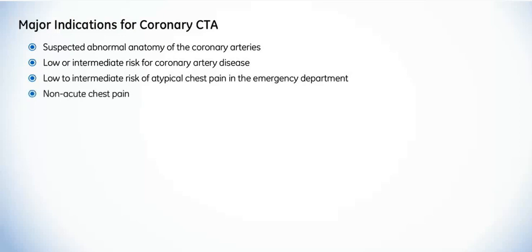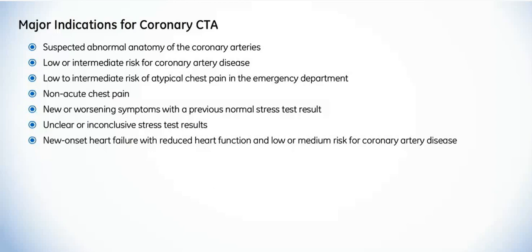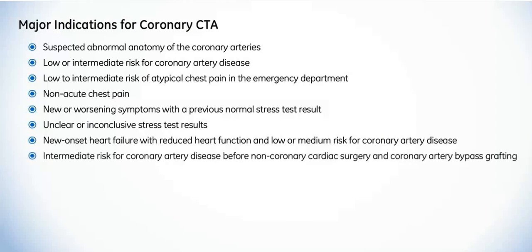Other indications include new or worsening symptoms with a previous normal stress test result, unclear or inconclusive stress test results, new onset heart failure with reduced heart function, and low or medium risk for coronary artery disease, intermediate risk for coronary artery disease before non-coronary cardiac surgery, and coronary artery bypass grafting.